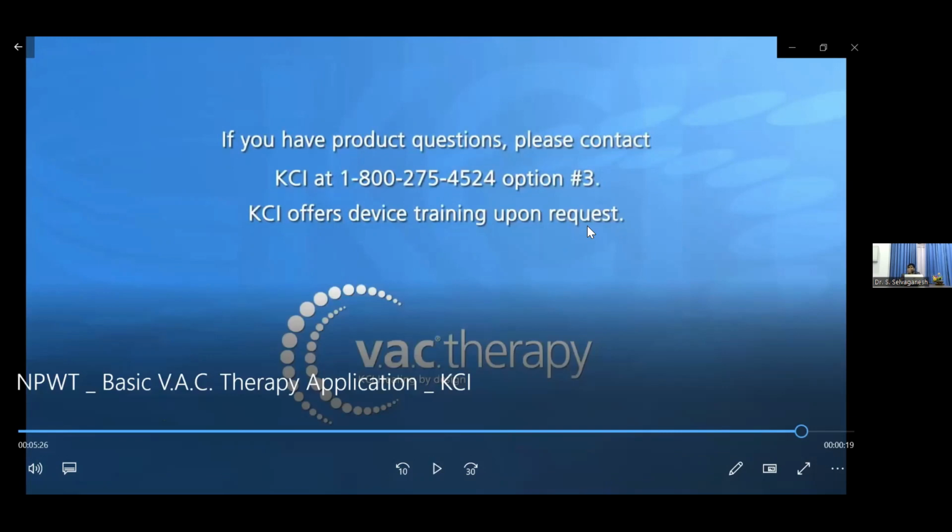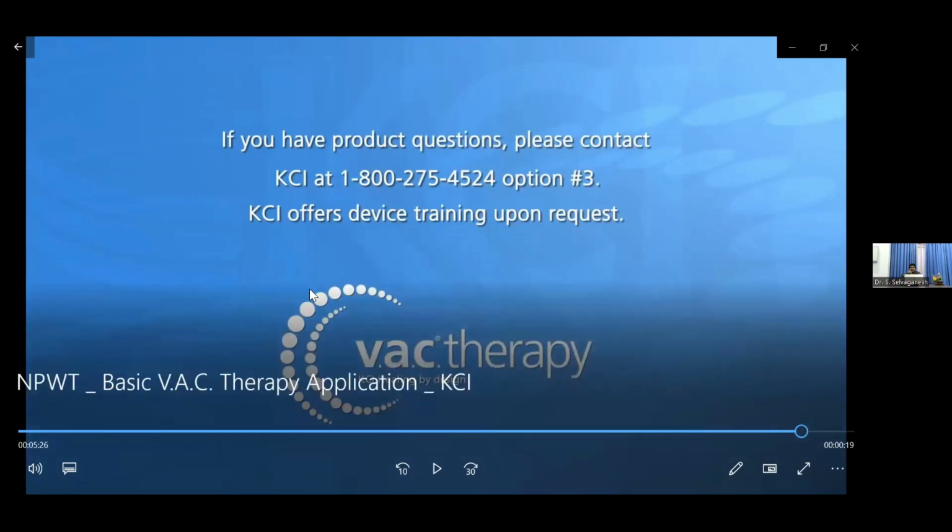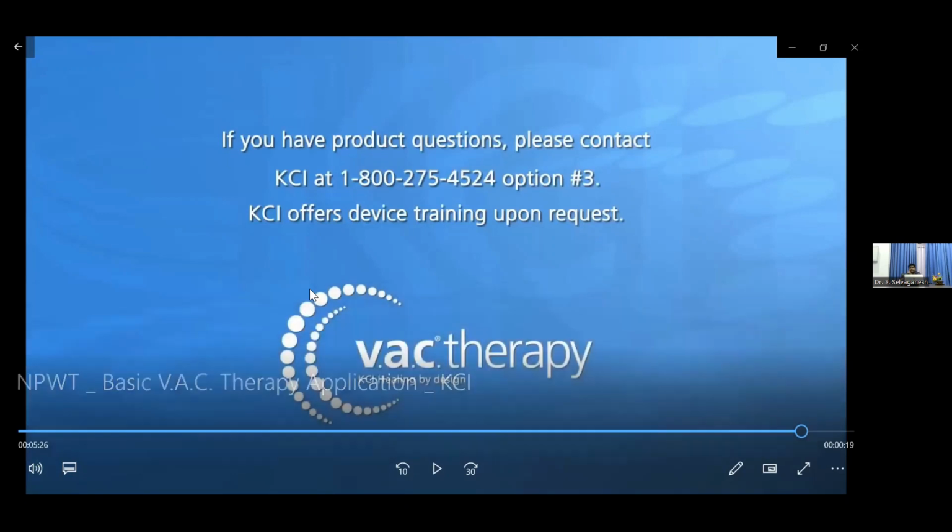For the question of how many cycles of dressings are needed for one patient, it depends on the wound factor, patient factor, and the reconstructive facilities available. Sometimes one cycle, sometimes two cycles, and sometimes I have gone for three cycles. So it depends on your experience and your patient factors.